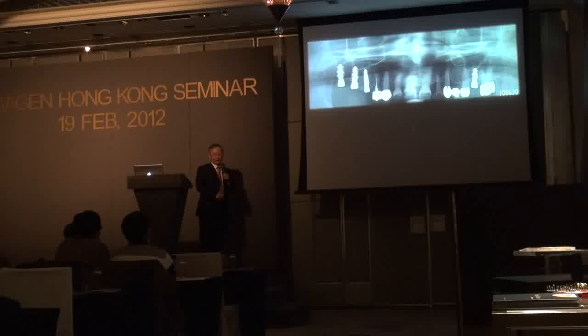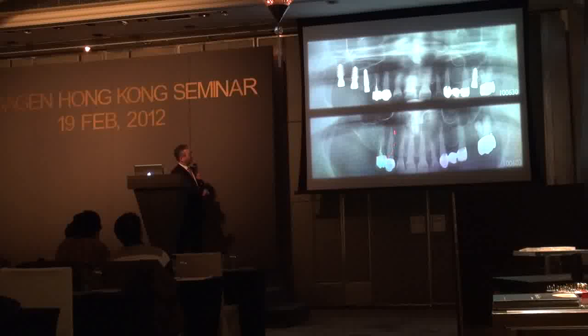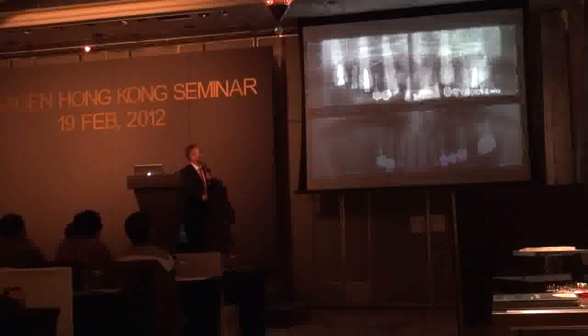And then this is after surgery. Let's compare. Look at the bone condition here. This area looks much denser than this area. So it is very logical to place different diameters, even though you made the same diameter of osteotomy sites.